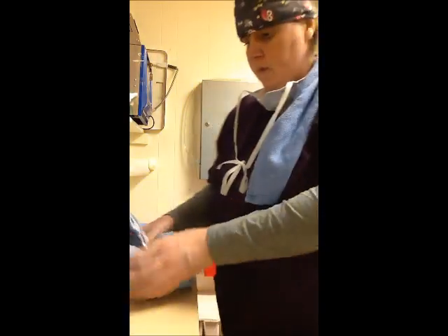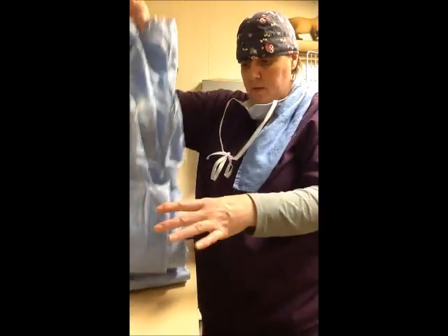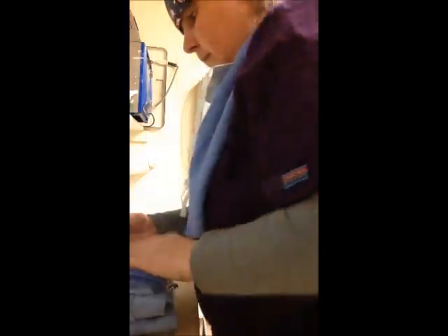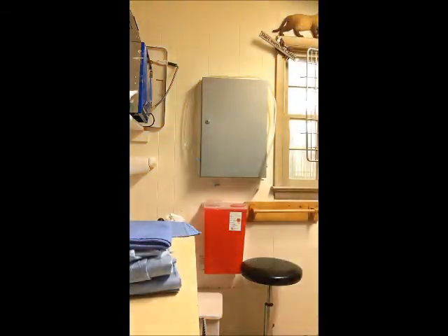Okay, and then it becomes an accordion, and the doctor can just lift it and pull. It comes right into its space. We wrap our doctor's gowns with a towel.